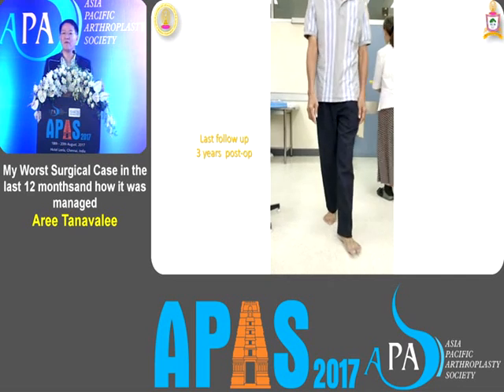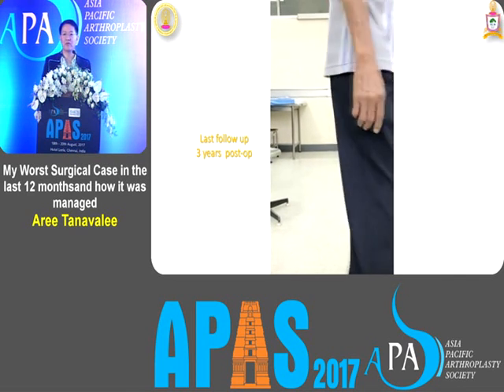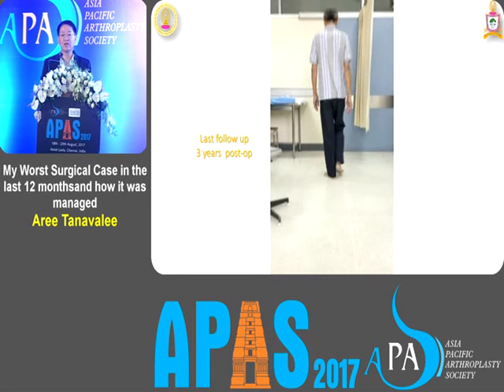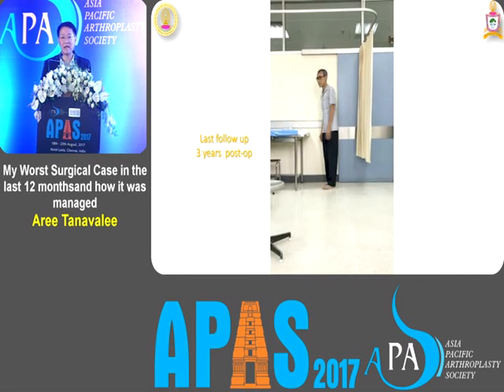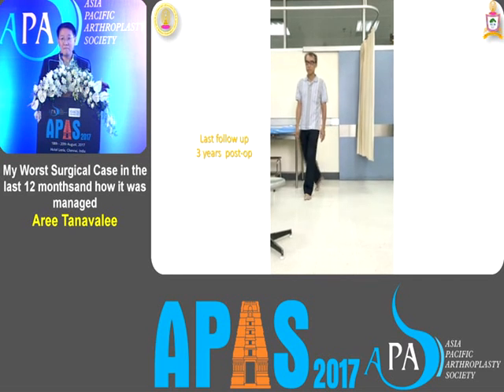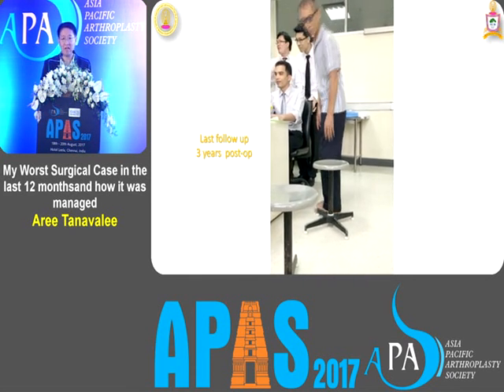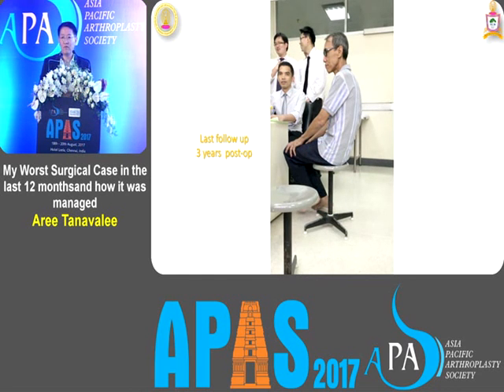So the lessons learned from my case. First, if you think the defect on the femur is 3A, sometimes even though you use a cylindrical stem with diaphyseal fixation, make sure it's not a 3-point fixation. It should be a circumferential fit, and you must test. If you find that the diameter of the canal is not big enough, so the diameter of the stem is not big enough, you must be careful that it can come loose.